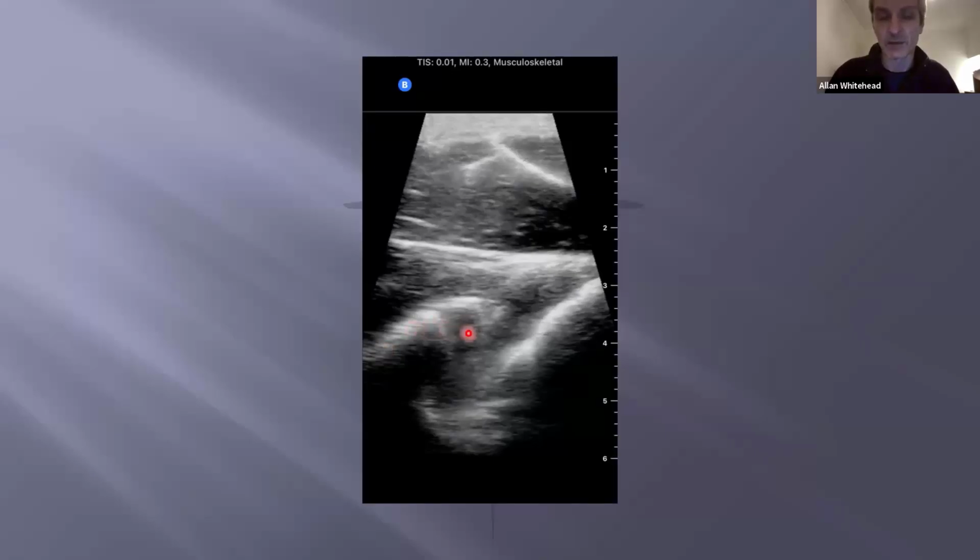I never got to do a reduction or a dislocation view. As I said, it popped back without anything while he was waiting. But this is the posterior approach, always posterior approach. This would be the right shoulder, because the humeral head is towards the right side of the screen as we're looking at it, with the glenoid on the left side, and you're getting a nice picture of the glenoid. You can almost say it looks a bit like an inverted V. There's the joint space, and then the curved humeral head, and they're lining up quite well. Classically, the humeral head is slightly closer to the top of the screen, where the probe is, a slightly posterior position, but certainly well within the normal range.